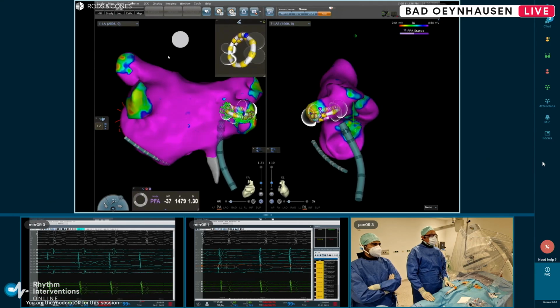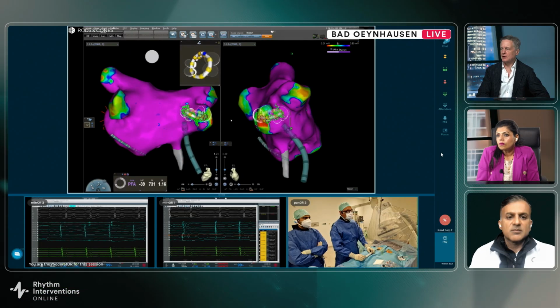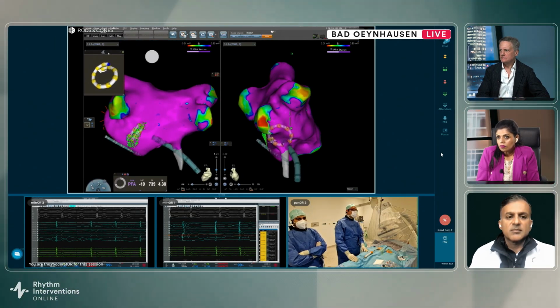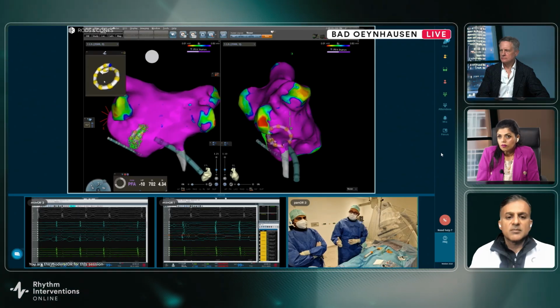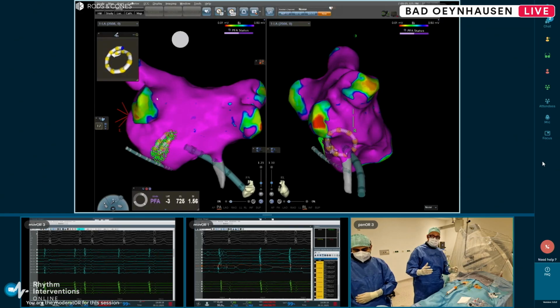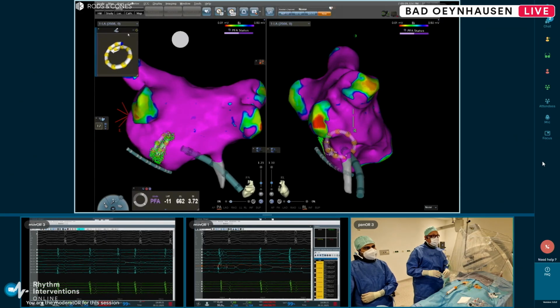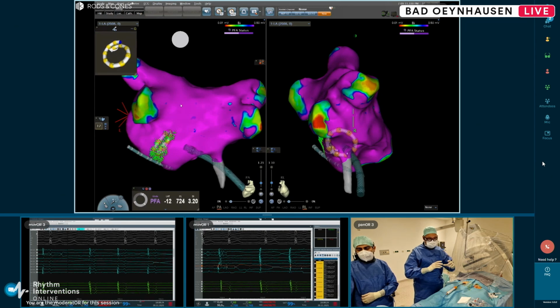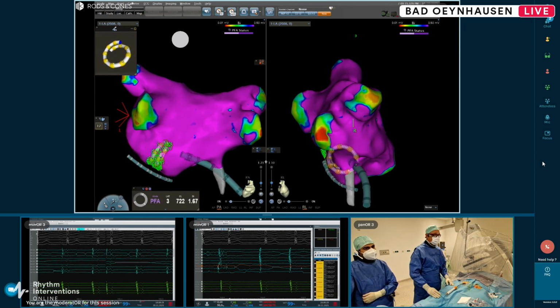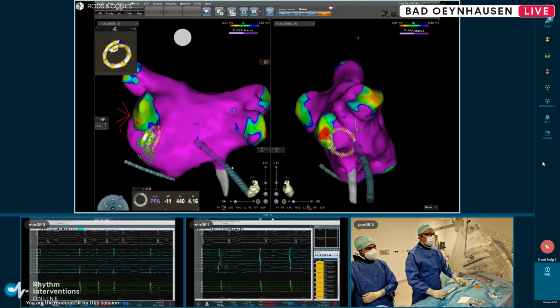Yeah, and so the calibration is the difference between the sheath and the blood pool is how you calibrate initially. Is that right? That's right, yeah. So you saw at the very beginning the catheter was inside the sheath and all electrodes were black. And it's like a self-learning process, which took time in the previous version. But now you finally can say, when you go out of the sheath, then you see ongoing calibration, and it's just a couple of seconds finally to have a nice map in these patients nowadays.